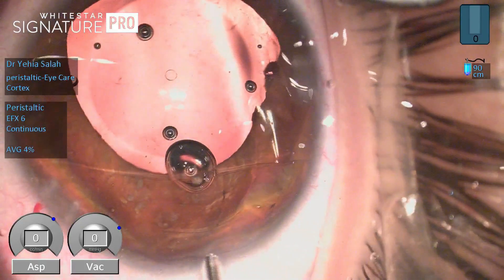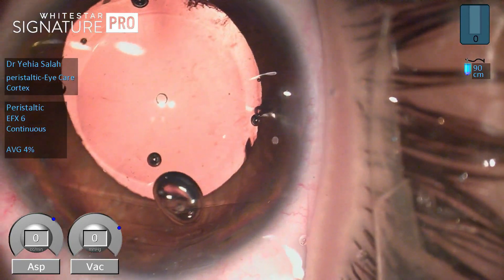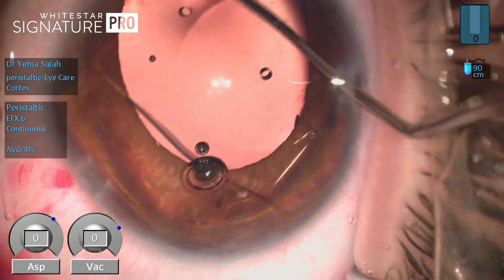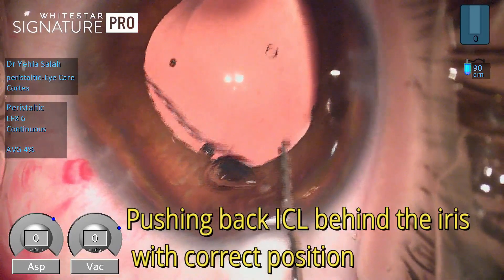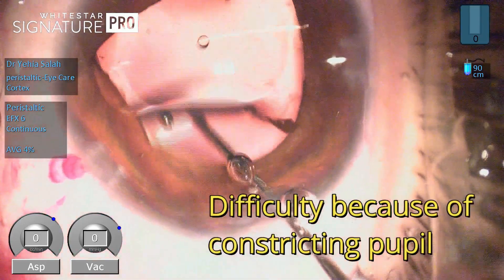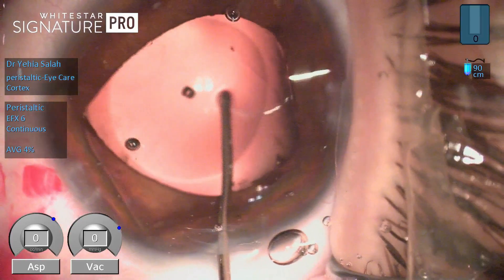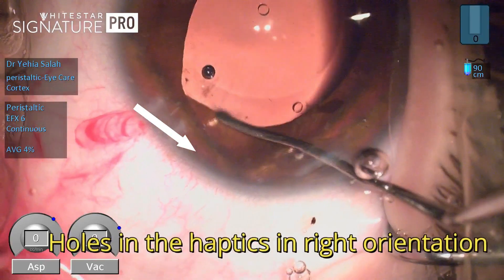Now the lens is in the correct orientation but still in the anterior chamber. The procedure then continues with the regular ICL steps: we flex the haptics to go behind the iris, starting with both leading haptics and then the trailing haptics through the main incision. The not-so-wide pupil makes it a little difficult, but whenever I feel I need viscoelastic I use it to protect the corneal endothelium, the anterior lens capsule, and to create space.